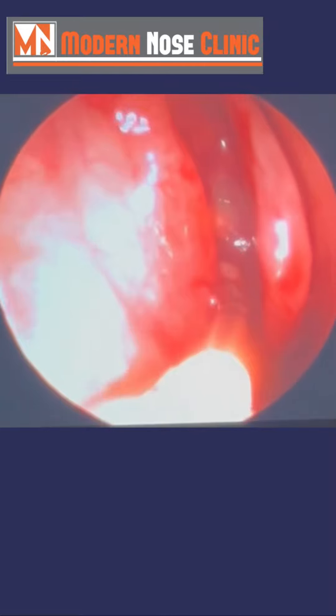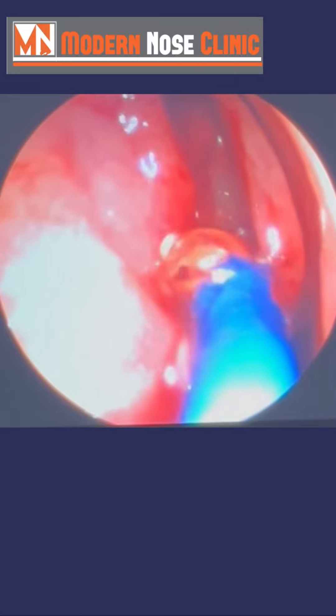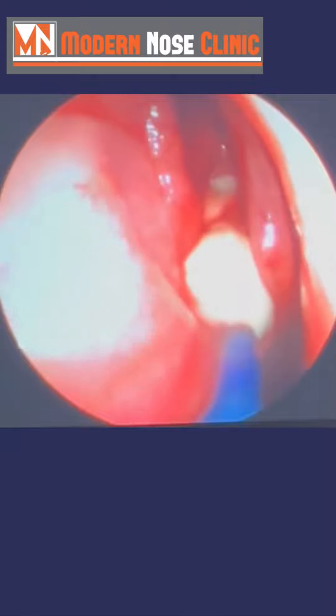And now we're in. We're going to advance the balloon over the guide and go ahead and inflate. You can see the infection coming out.